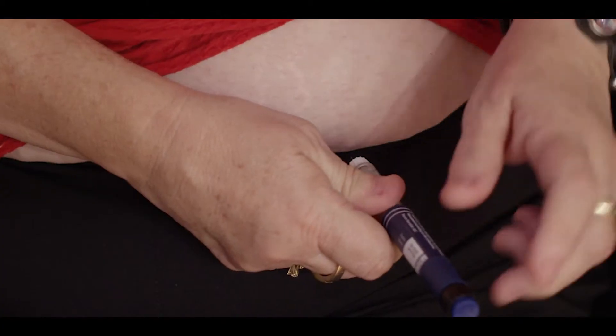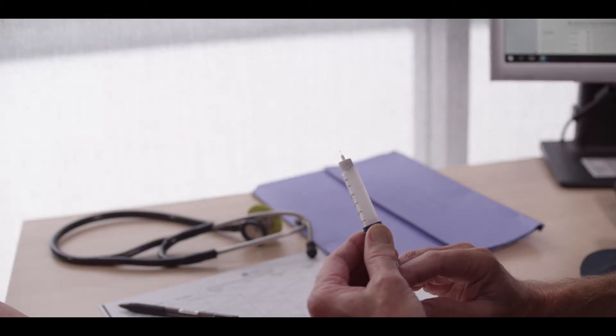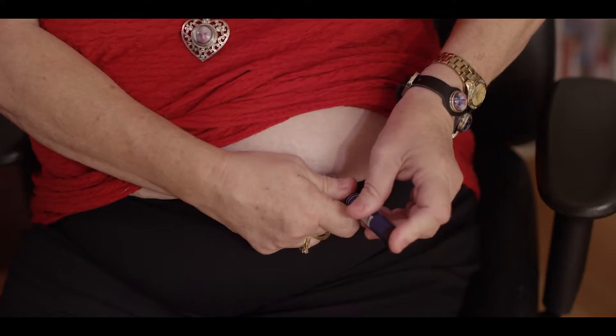To ensure the insulin is absorbed at a steady rate, it should be injected into the subcutaneous fat, which is the fatty layer between the skin and the muscle. Most people use a 4 to 6 millimeter needle, but it must be directly into the skin and not through your clothes.